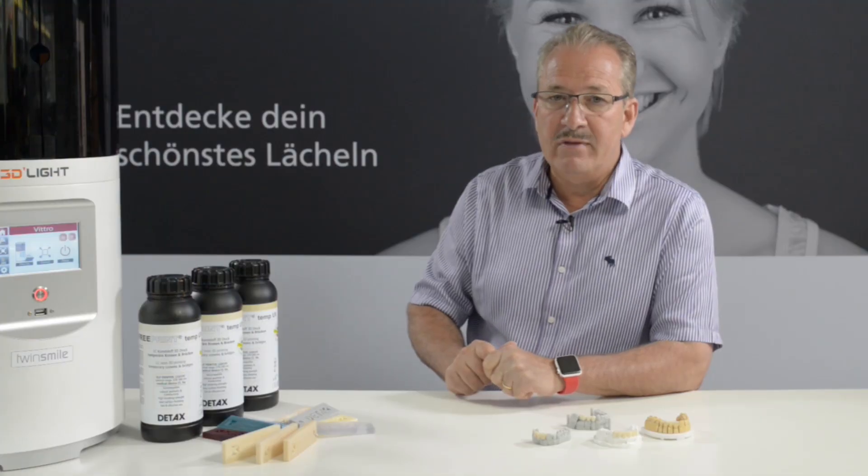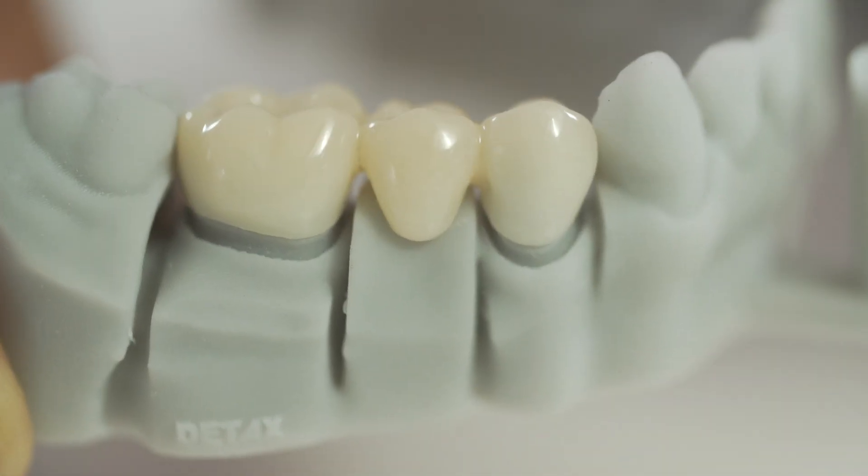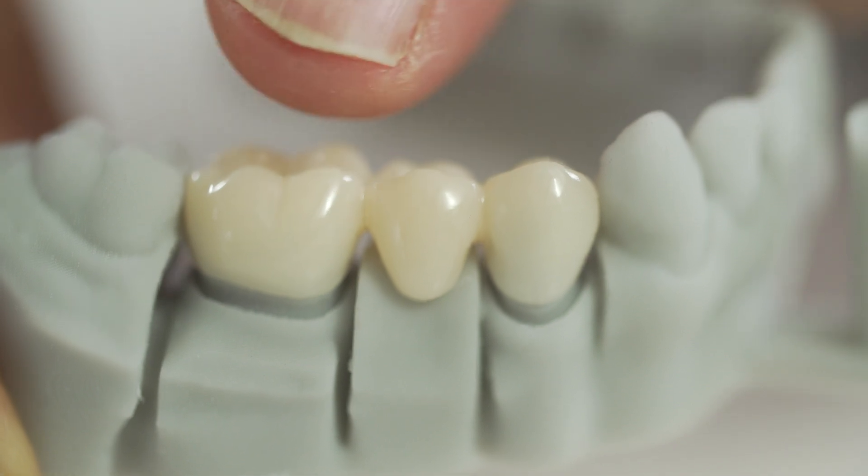If you have a 3D printer like the 3D Light 3D printer, you can produce them in 15 to 20 minutes. And it doesn't matter if you print one or 20 of them.